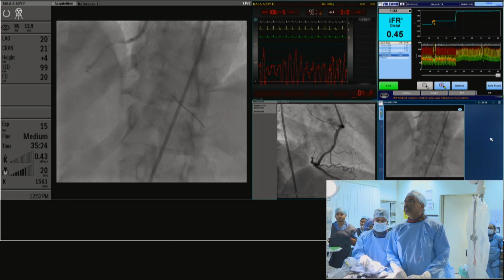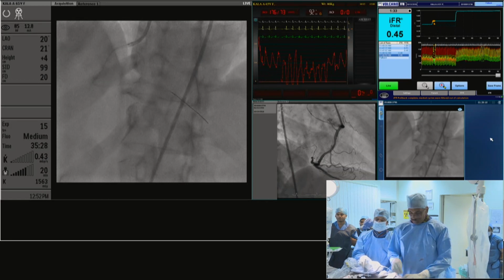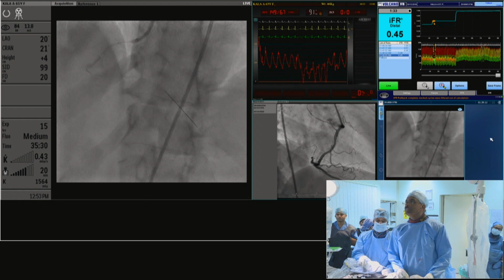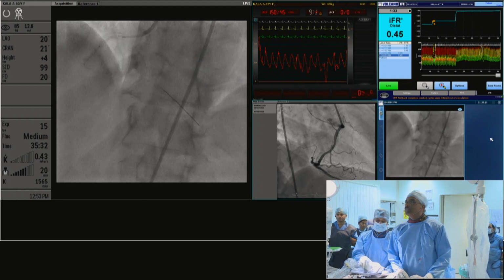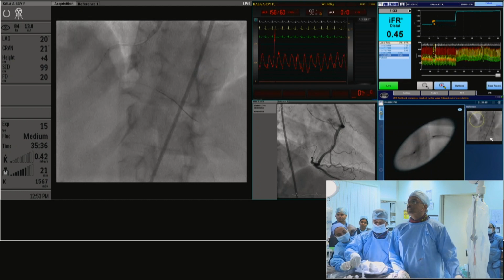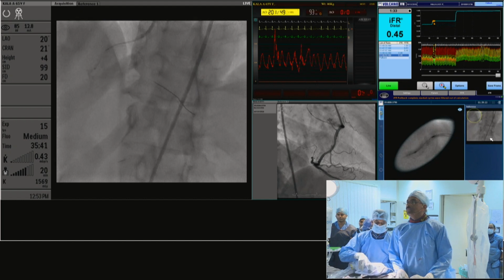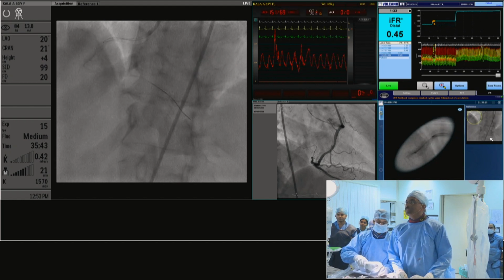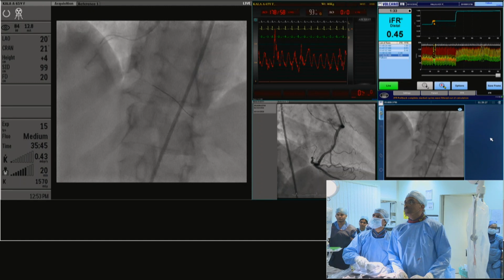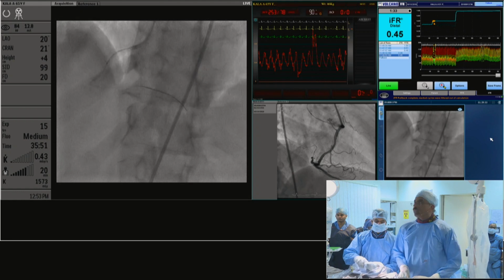So my message is, get your best stent. It was a discrete lesion. I would have got a discrete stent out there prior to the bifurcation. And the lesion in the PDA, as you know, on IFR was not significant either. So there was only a single discrete lesion which needed to be treated. That's how I would have done it. I don't think I would have changed the prognosis of the patient in any way. It could have been similar, if we take into account that we've now put 38 millimeter stents into him as well.